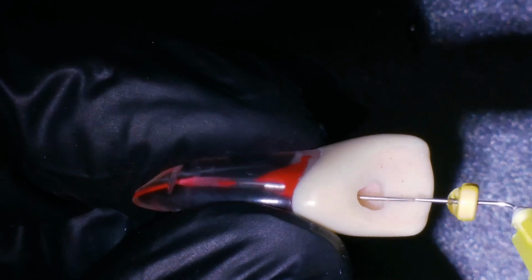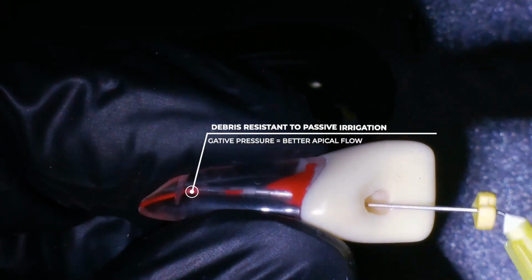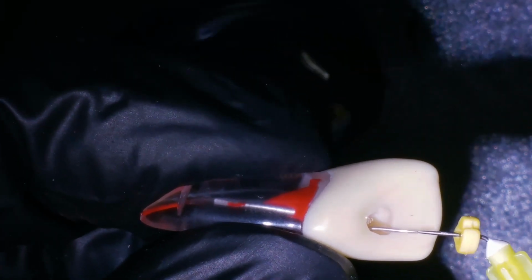Using high suction during irrigation, known as negative pressure irrigation, is extremely important because the irrigant solution will flow only in the widest portion of the canal, leaving debris behind as noticed here. For this demonstration, negative pressure is achieved using the syringe.